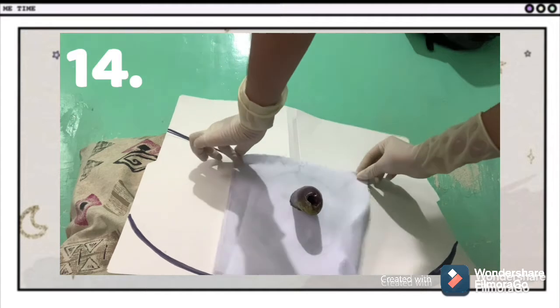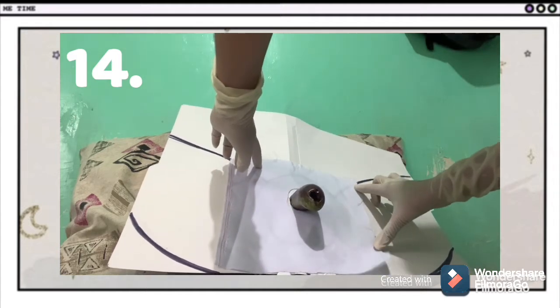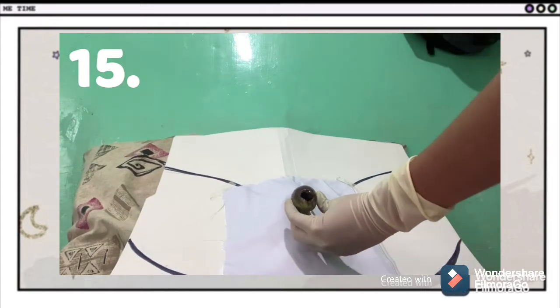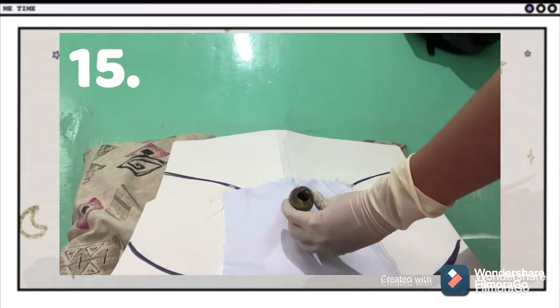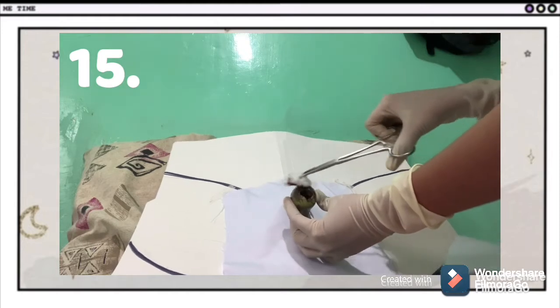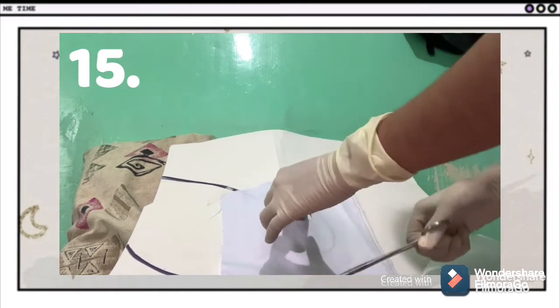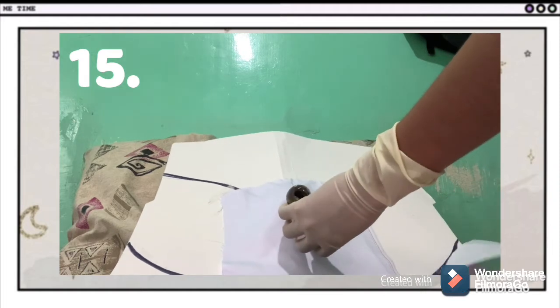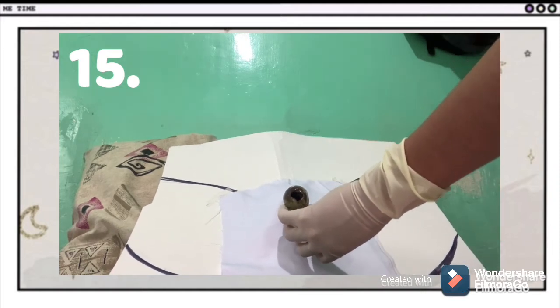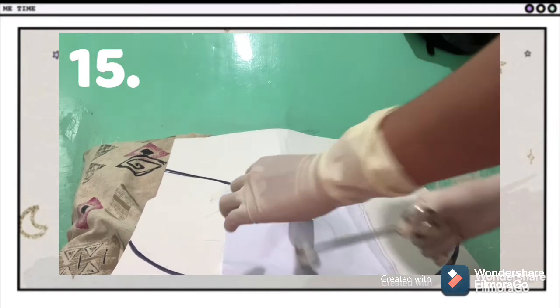Place the fenestrated drape aseptically over the perineal area with the penis extending through the opening to provide a sterile field. Holding the penis with the non-dominant hand, disinfect the meatus twice using cotton balls with betadine antiseptic solution, using a circular motion, then downward, for each cotton ball, and discard. The rationale: it cleanses the area and minimizes the risk of urinary tract infection by removing surface pathogens.